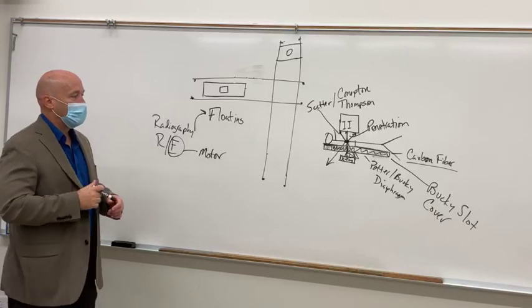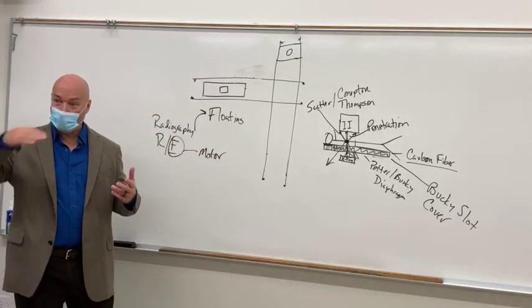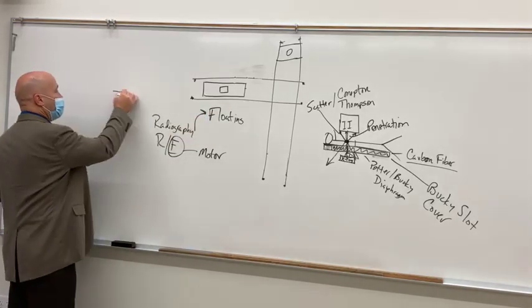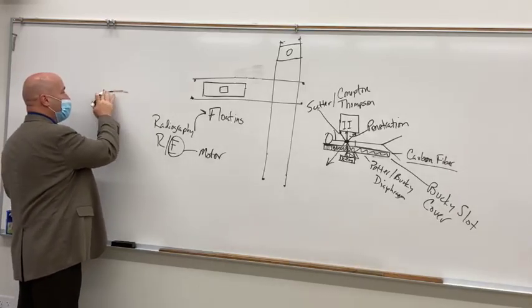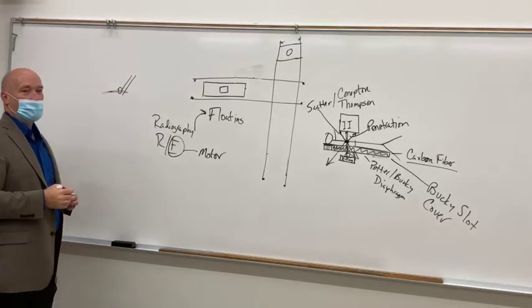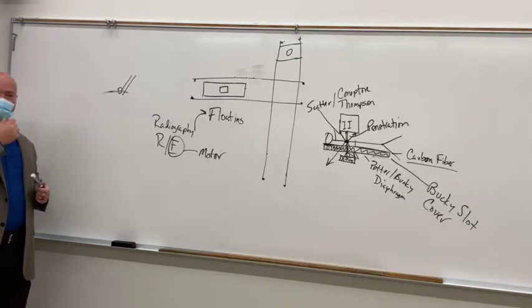And depending on whether or not they've got a lot of compressed discs or whatever, they may tilt them up quite a bit. So again, can you imagine being on an x-ray table? They already stuck your spine, and then your head is down, you're hanging on the table, and the table's like that, and then it starts to move. That'd be bad, right?